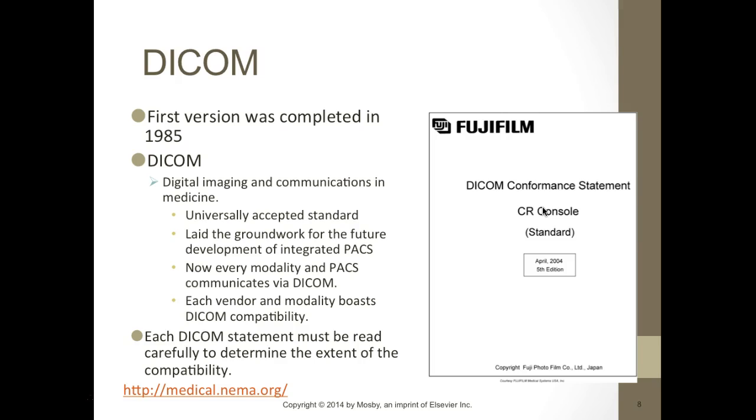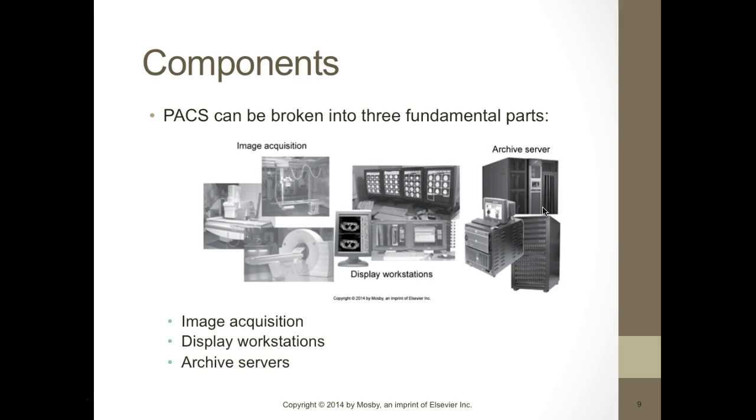Now every modality in PACS communicates via DICOM. So the DICOM is the language in which it speaks. So each modality or each vendor and modality boasts DICOM capability. So they all say, oh, DICOM compatible, DICOM compatible. So each DICOM statement must be read carefully to determine the extent of the compatibility.